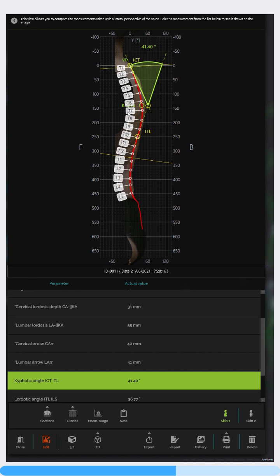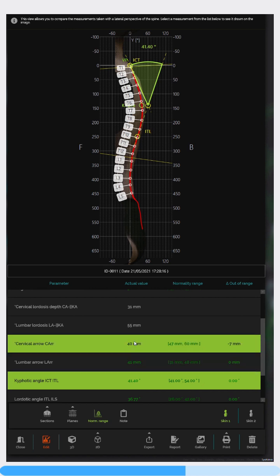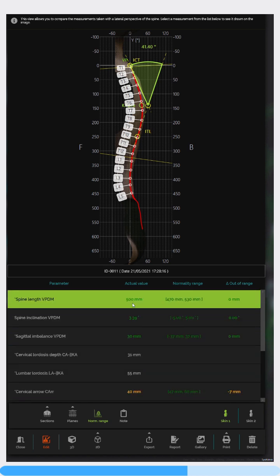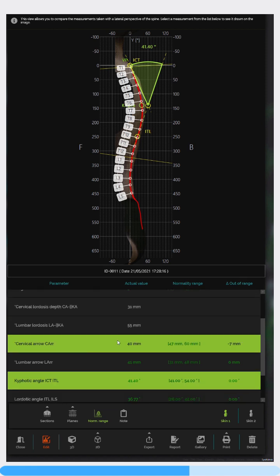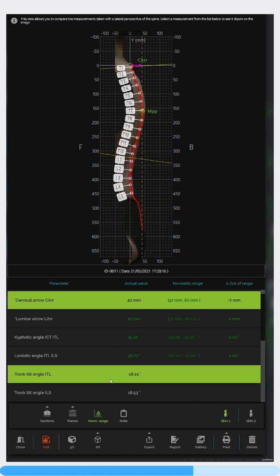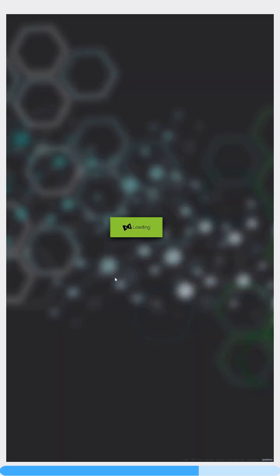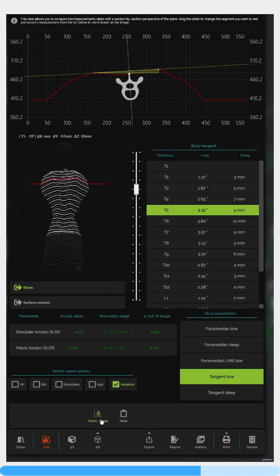So we have a slightly increased upper thoracic kyphosis, which the peak of that does match where her rotation and curve point is. And then we can click on the normative range, and this will, like a traffic light system, tell us the areas that are red, amber and green. So there are some amber concern areas, but nothing red. This does match her presentation. Medically, never been diagnosed with anything formally. Symptoms have been chronically managed from a symptomatic perspective, be that by painkillers, massage, etc.